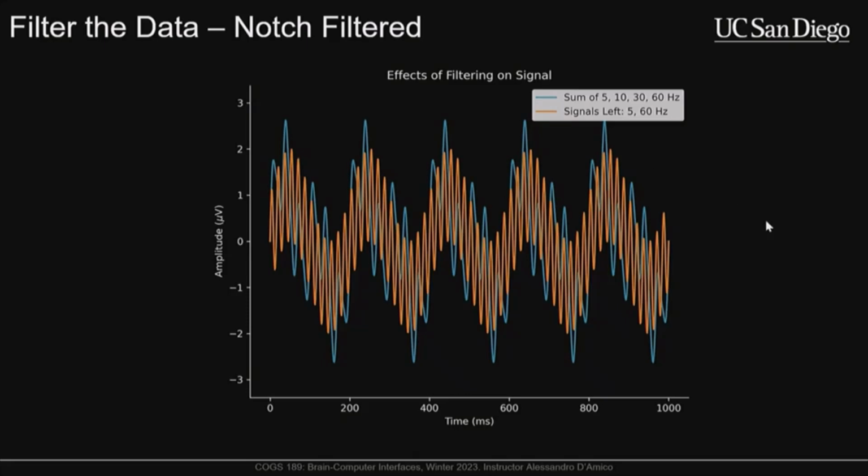And in fact, I like to joke about how, in a lot of ways, EEG signal processing is cheaper and easier than audio processing, right? We're sampling our data at, on average, 500 hertz. Audio is sampled at 44 kilohertz, way faster. The filters are way more aggressive.